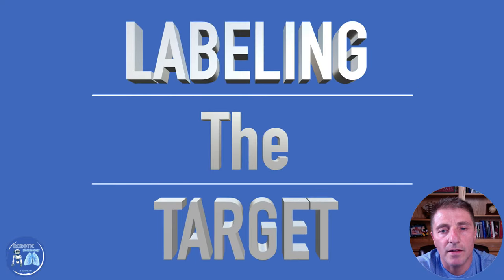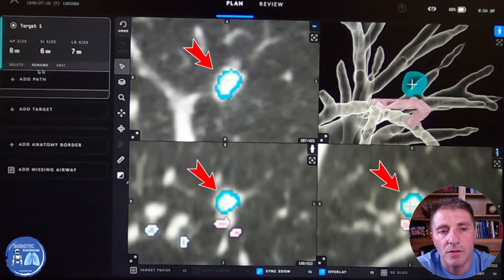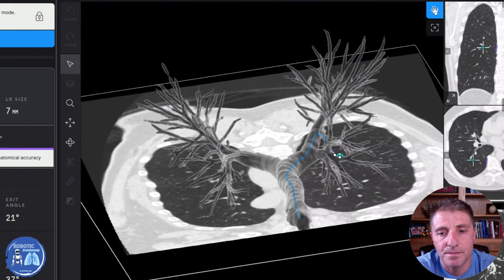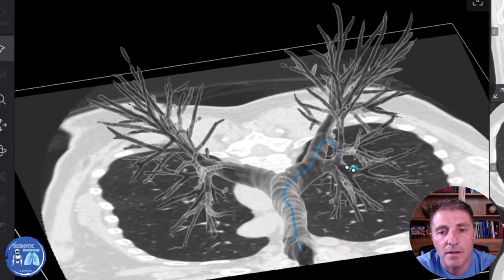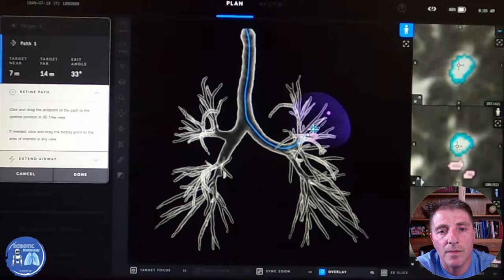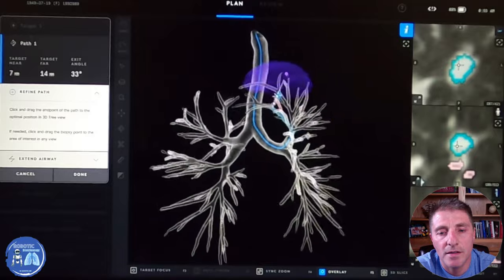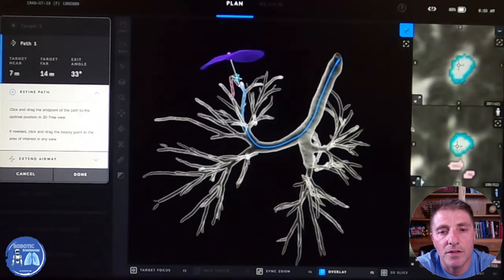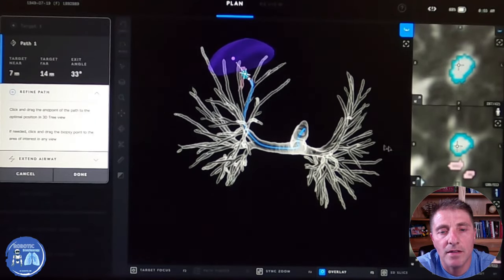After we find the bronchial tree, we move to labeling that nodule. When we label the nodule, the computer identifies it as the target and labels it as a blue circle. That also helps us find it through the bronchial tree. Now we have the target and the bronchial tree, and the computer creates GPS guidance on how to drive through the main airway to the bifurcations and turns in the airways until we reach that target.